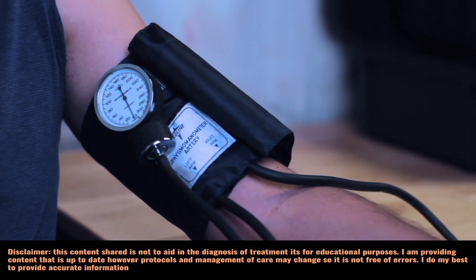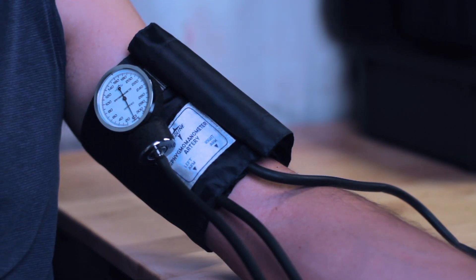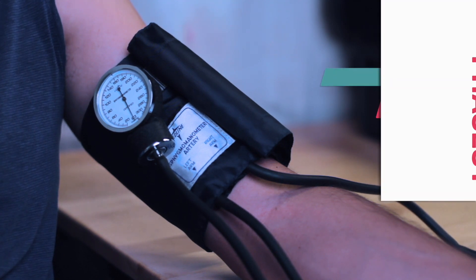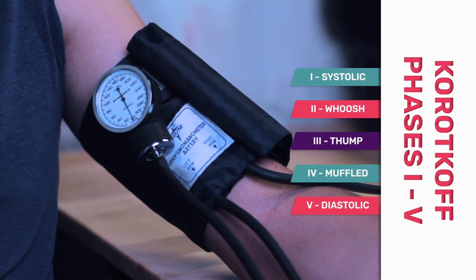And then just to take it a step further, with the Korotkoff readings, they go into phases. So phase one through phase five.